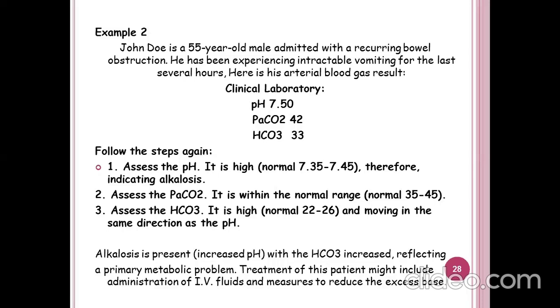As you all know, these are life-threatening conditions. The ICU patient gets all these parameters checked within a short interval of time. So you must know about ABG analysis and its interpretation.